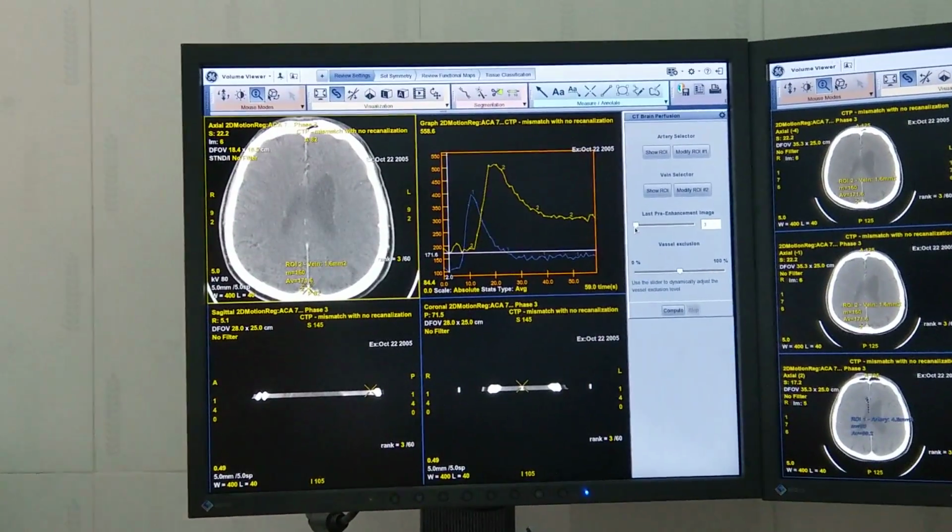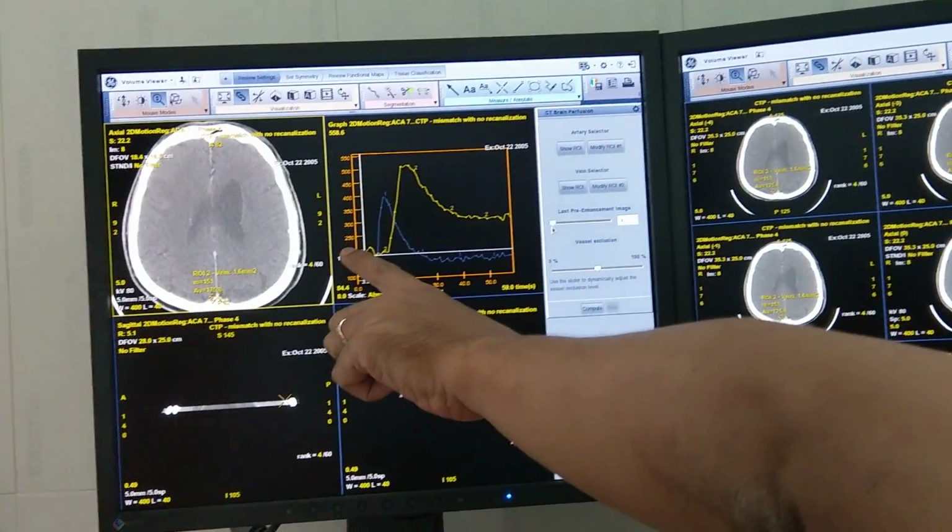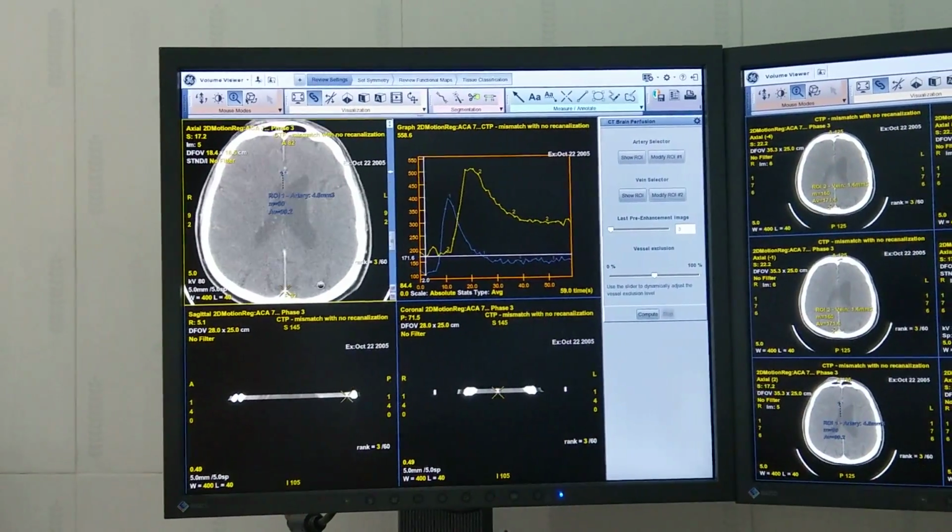I think you touched the bone because your baseline is very high. You think you touched the bone.